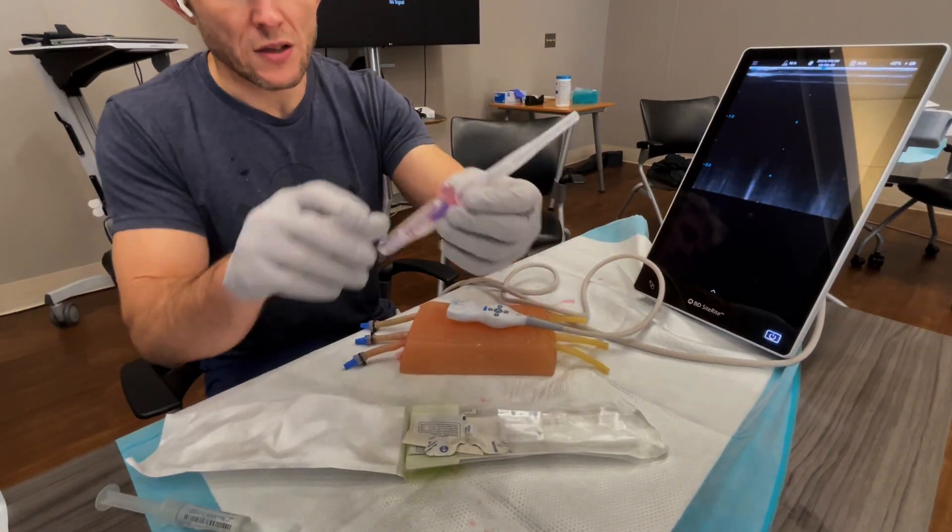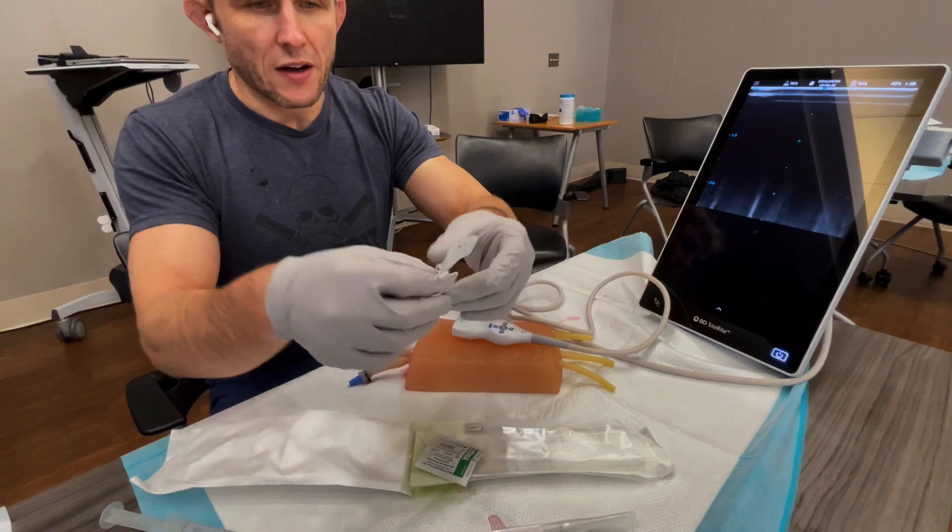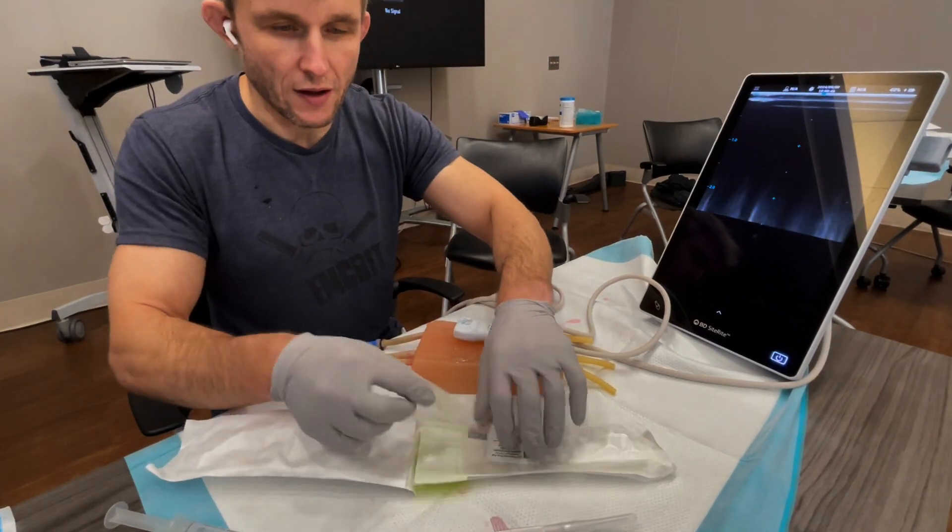What's inside here is your self-contained midline, which we'll go over in a sec, and then an adhesive attachment tool, and then your label.